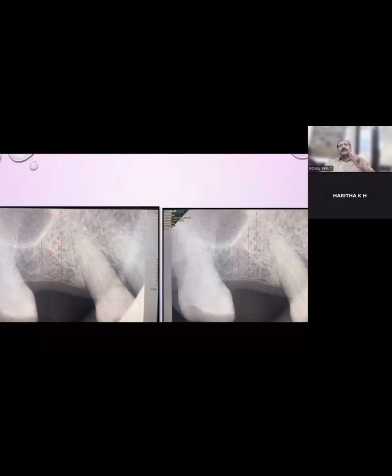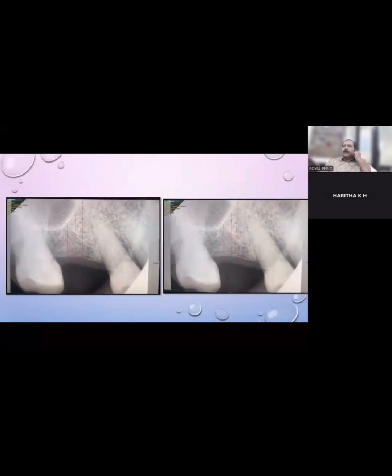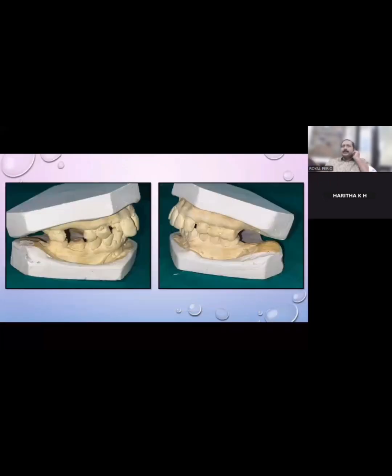That can be assessed only from the cast. So where's that model? Yeah, I think you have shown the photograph also in that. Yeah, this model, you need to assess how much is the undercut of this region. How will you do that? Yeah, place a flat instrument exactly corresponding to that migrated 7. So you'll get an undercut underneath it. So that has to be marked first. That region has to be marked, and that area of undercut has to be calculated.